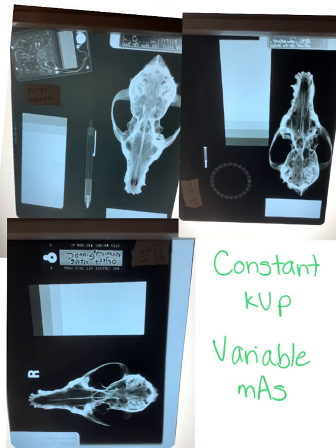In this set of x-rays we are going to be looking at variable MAS x-rays. On these three films, the KVP stayed the same — every one of these was shot with a KVP of 40. So the exact same force of x-rays hit each one of these three films. The only thing we changed was the MAS — how many x-rays are hitting the film. Constant KVP, variable MAS.